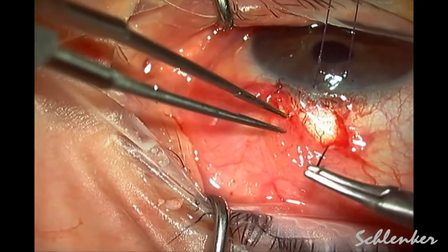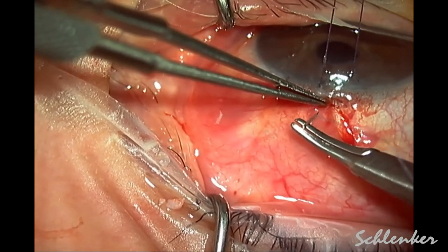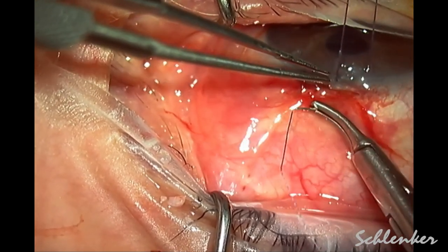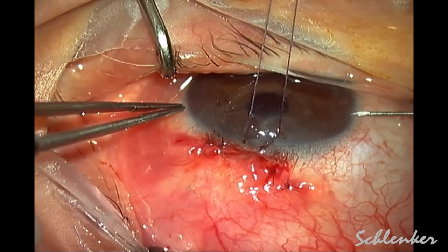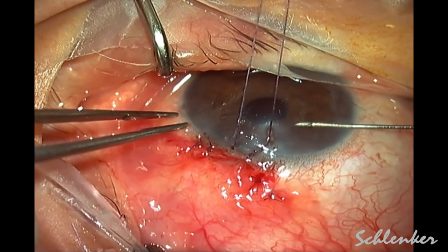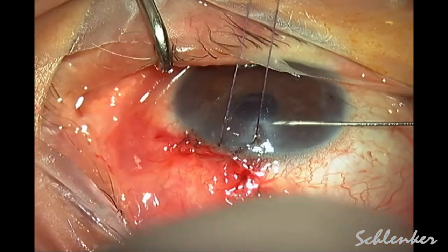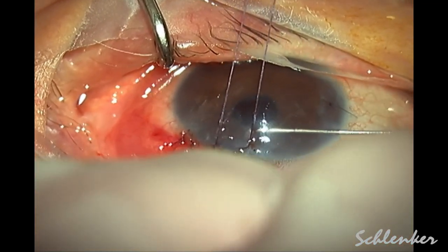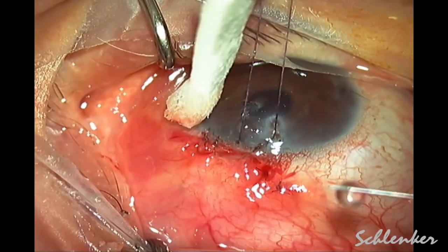My experience with the micro stent and micro shunt is that it is rare to have issues at the limbus, so the conjunctival closure is important but does not have to be perfect. I would be a little more concerned about the radial area, which has now been exposed to mitomycin on several occasions. Here we are just doing that injection and assessing the area using a Weck-Cel sponge.